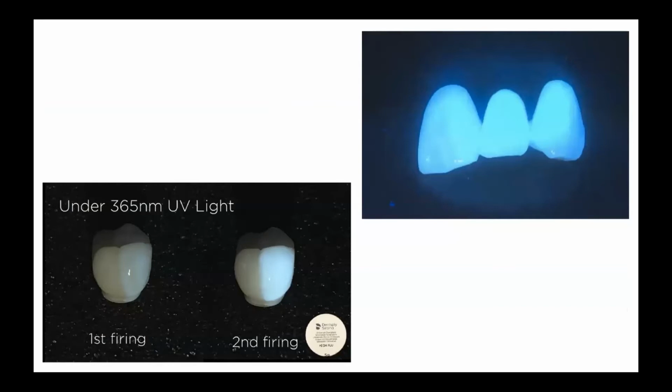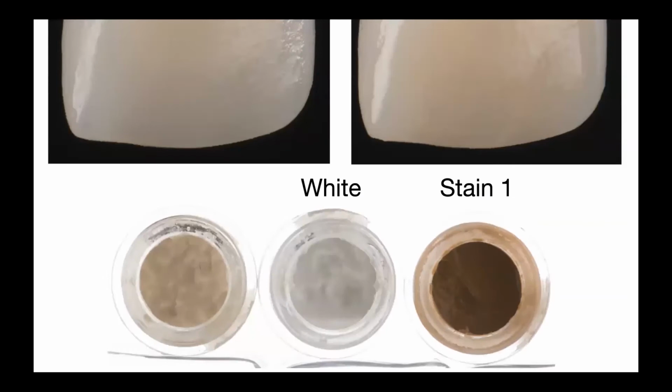As a rule, all ceramic framework materials such as zirconia, lithium disilicate, or the new generation silicates reinforced with zirconia are not fluorescent enough. But we don't have such a problem when we use framework materials that contain feldspar as a basis. But this kind of material has a very serious disadvantage. It is not as strong as zirconia and lithium disilicate.